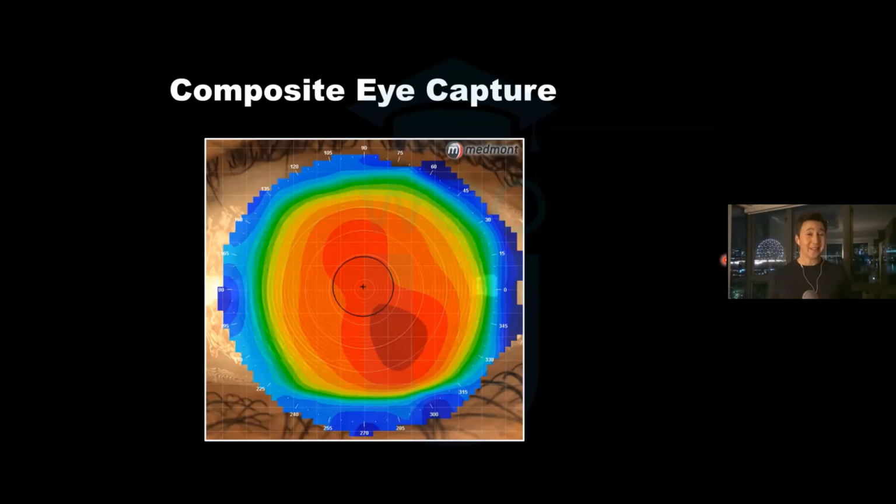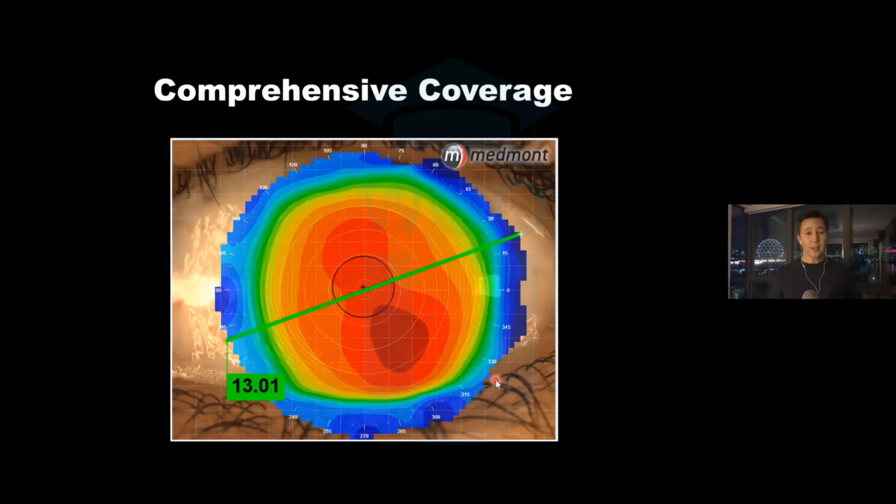I love that I can get more data out toward the periphery, especially in a case like this. You notice that this patient has a lower lid that's relatively high in relationship to the cornea, and I can have the patient look up, and then I can take a photo and get some data points on that inferior cornea. Same thing with looking down. I can get some more data points up there at 12 o'clock. So this might be an important tool moving forward, but we'll wait for the WAVE team and their guidance on this one.